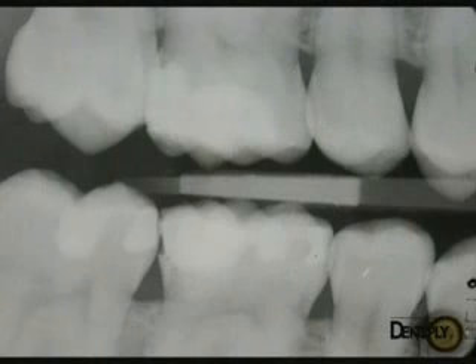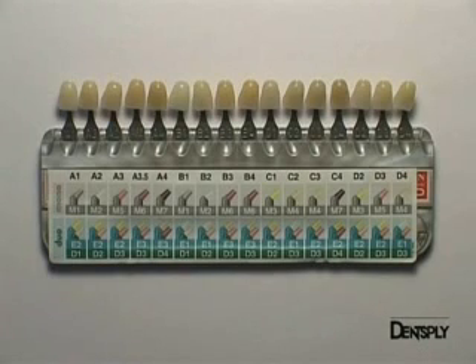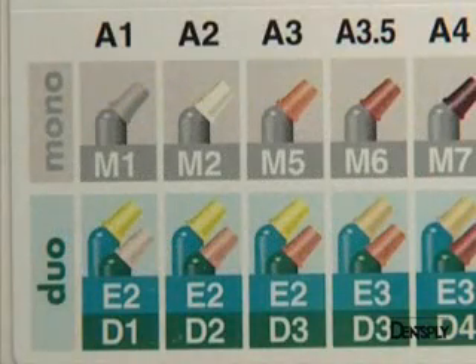The preoperative x-ray plate shows the volume of the existing restoration and the problem of adaptation of the distal portion. The choice of shade is made using a Vita shade guide; an A3 shade is selected for good integration with the surrounding teeth. In the Ceramix Mono shading system, the A3 shade corresponds to an M5 shade that will fulfil its aesthetic function well in this posterior situation.